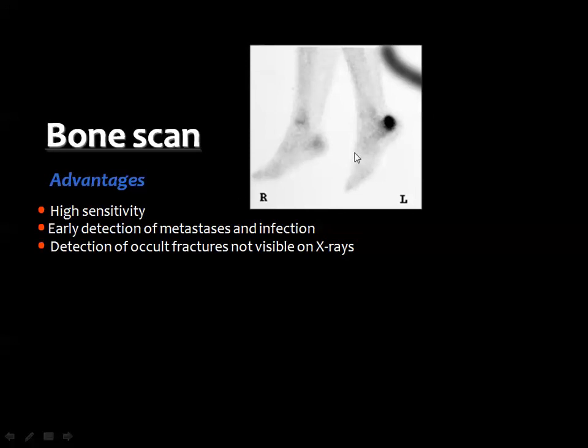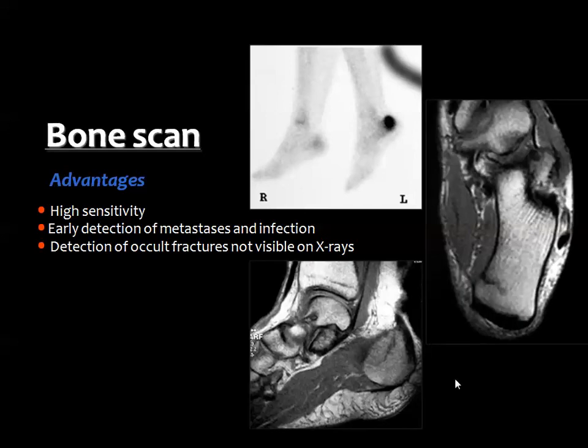And look at this case where the patient had a painful heel. The X-ray was normal, and the bone scan shows an area of increased uptake here. Then what do you think of this? Is it a fracture? Is it an infection? Is it a tumor? Then this is MRI, which showed the stress fracture in the posterior part of the calcaneus.